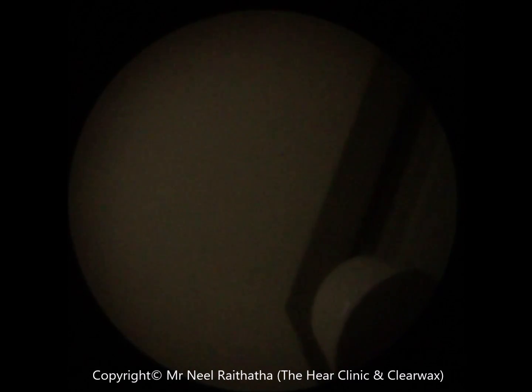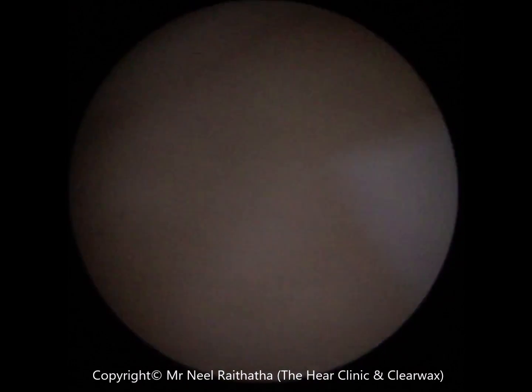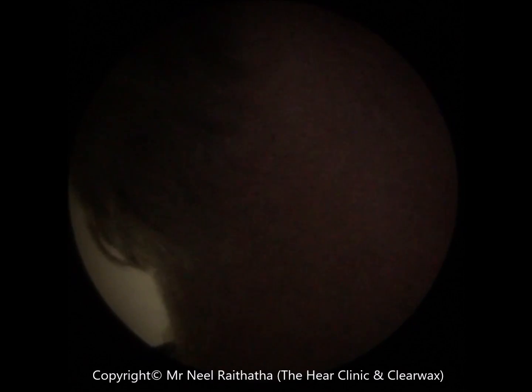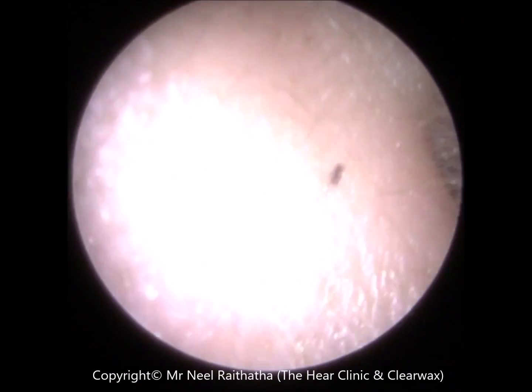Wasn't painful for you at all? No, not at all. Pleased to hear that. You seem very relieved. Suck it down the tube, doesn't it? It goes down the tube and into the canister in there, especially when it's soft wax like yours. When it's harder wax, we get big lumps that get stuck to the tip of the tube, and we can then show you on a tissue. But not everyone likes to see it. But with this, it's going up the tube anyway. So it's exactly the same thing for this side.